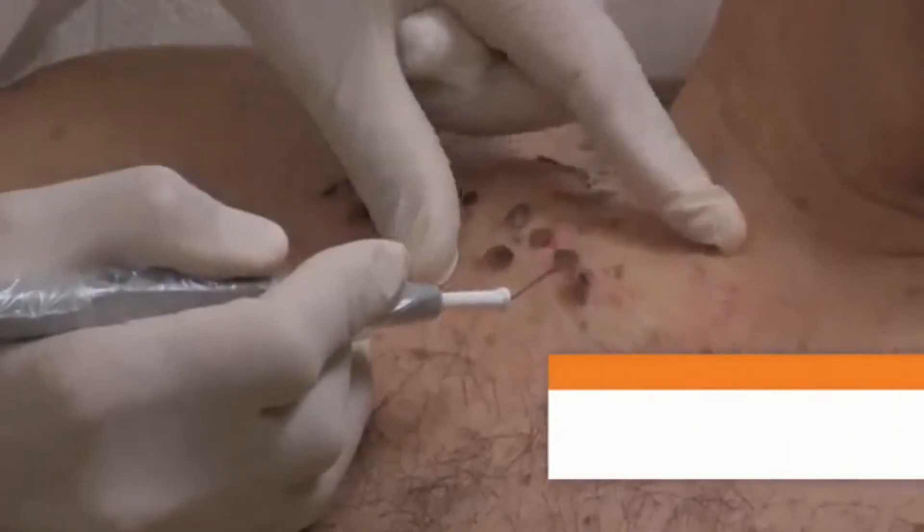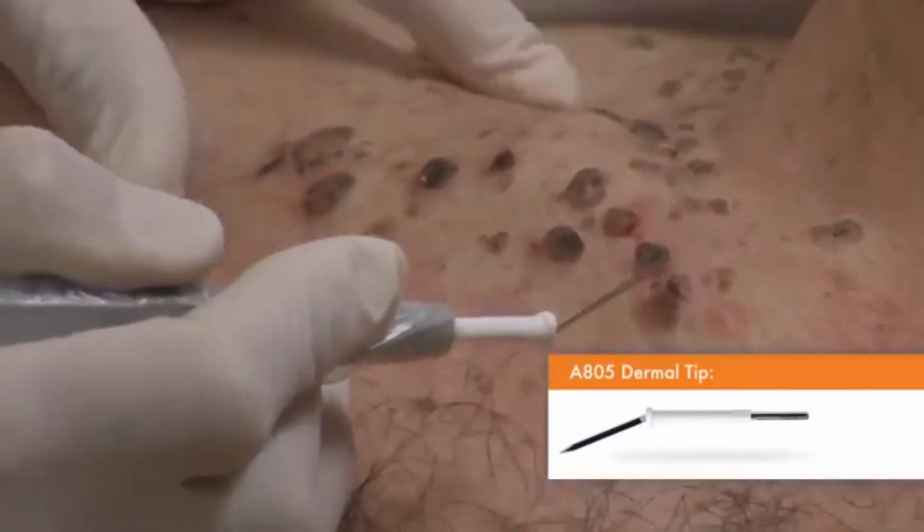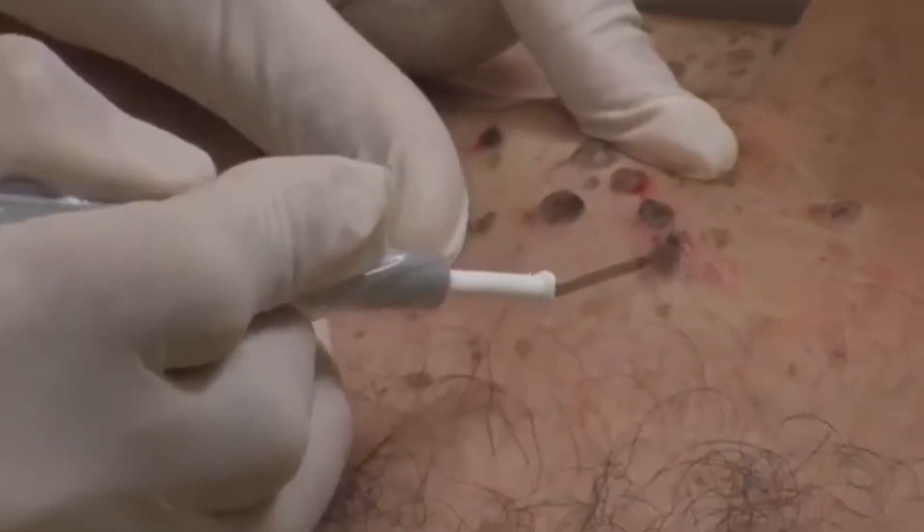A BOVI A805 sterile sharp dermal tip electrode is being used for the procedure. For the larger lesions, use the side of the dermal tip to electrodesiccate a greater area of the lesion at one time. For small seborrheic keratosis lesions, the tip of the A805 can be used. Having been electrodesiccated, we now proceed with the curette, effectively removing the lesion. Most of the seborrheic keratosis lesions require only one single pass.